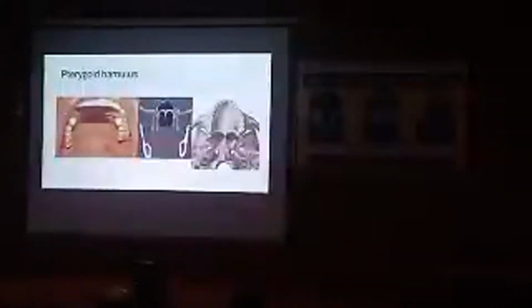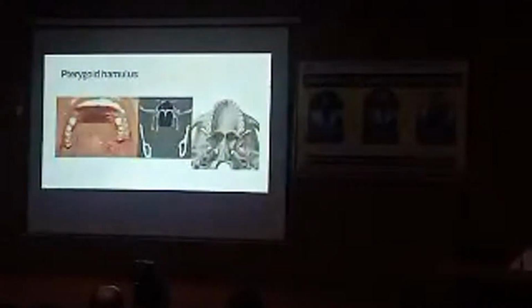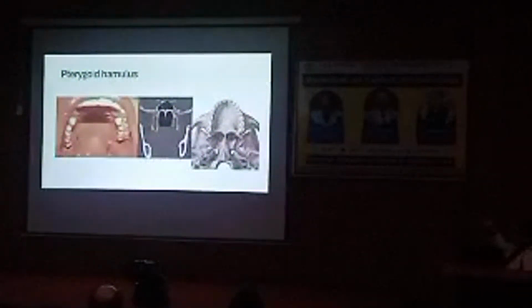For tapping, there is another instrument I will show you. But what we need to learn is this: you should be able to palpate this, and we will be going parallel to this. Keep your drill here, move parallel on the ridge, and if you dig, and there you stop, decide your vertical angle, and when you dip in, definitely you will find the pterygoid.